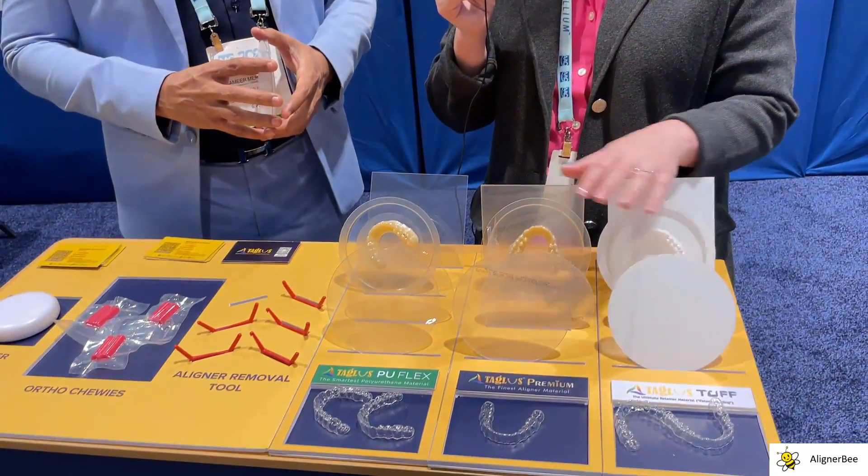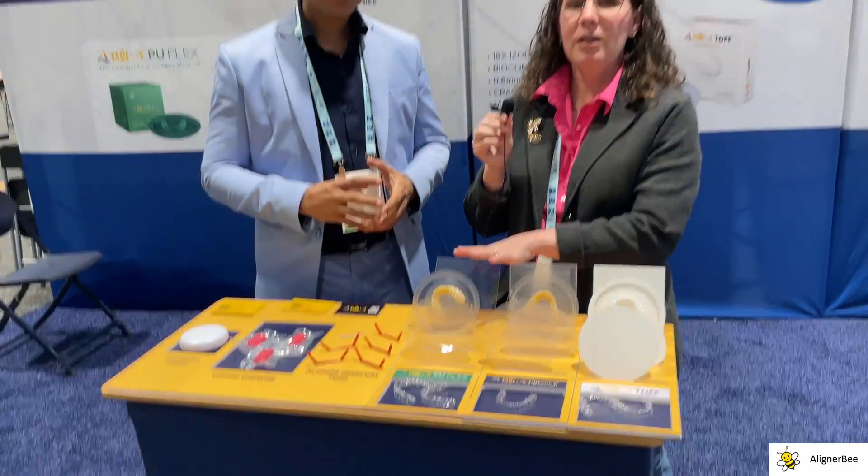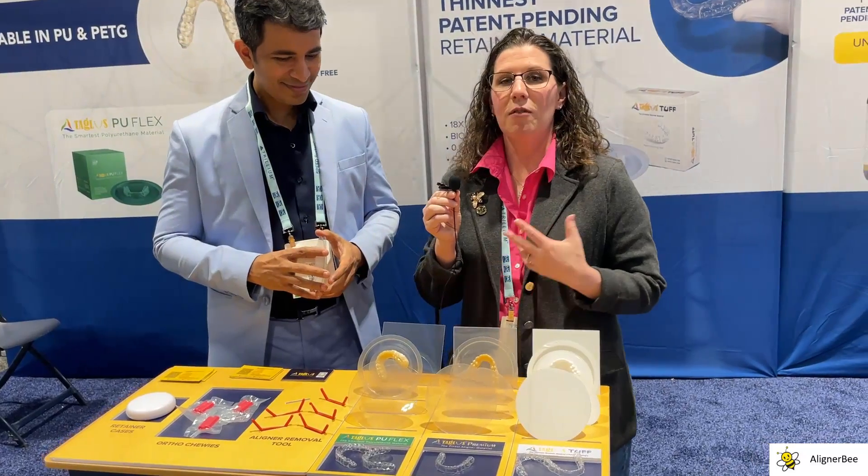One of the questions that I'm most commonly asked from doctors is what materials to use. There are some fantastic materials available on the market. The challenge is really finding out the different ways that we want to apply these because they all have unique properties. So I've invited Samir from Taglus today to join us. Taglus has released a new polyurethane material here at the AAO meeting, and I've invited him to discuss some of the properties with us in the aligner space.